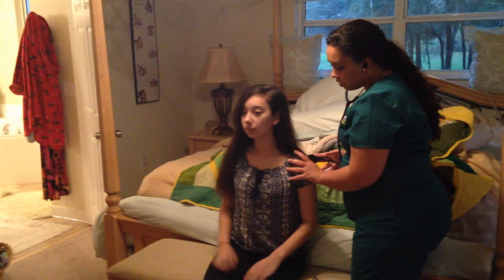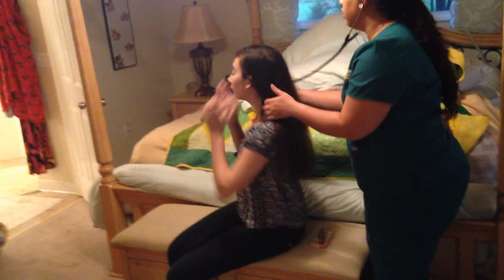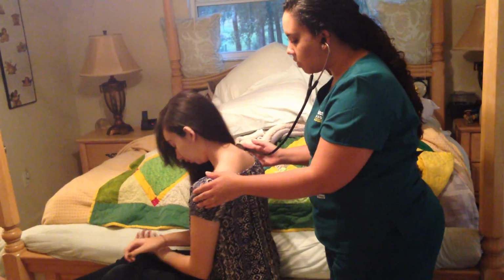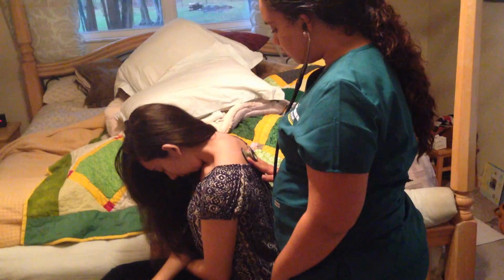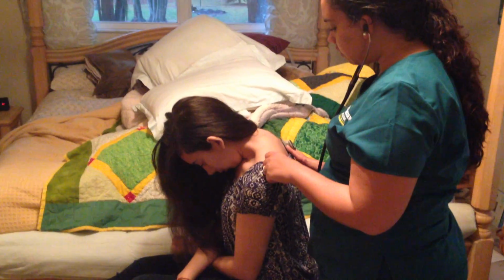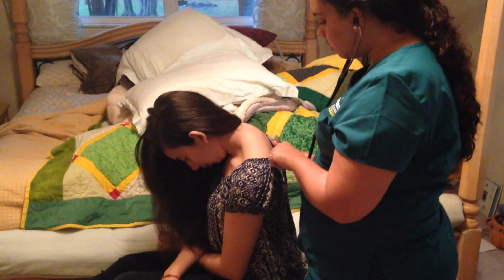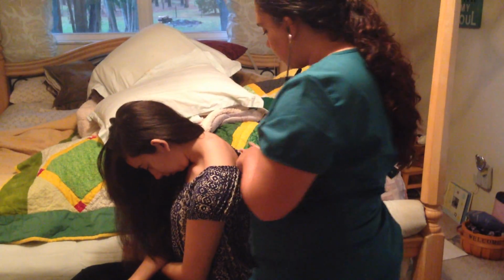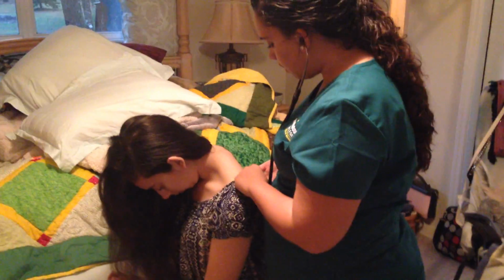Okay, good. If you don't mind turning over a little bit for me, I'm going to listen to your back. And here I'm just listening for the same things, just the back of the lungs. You mind crossing your arms so I can get in between your shoulders? Deep breath. Deep breath. One more.